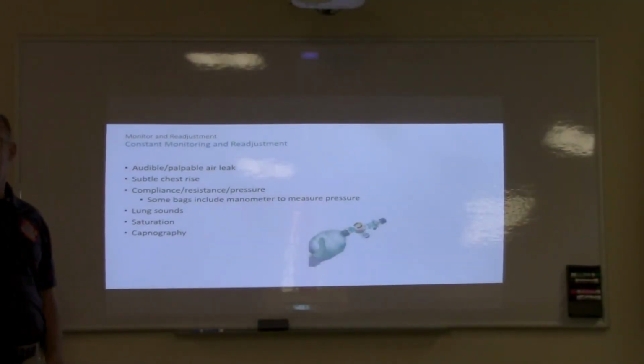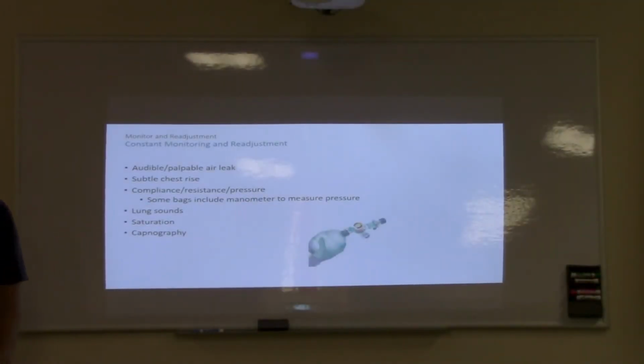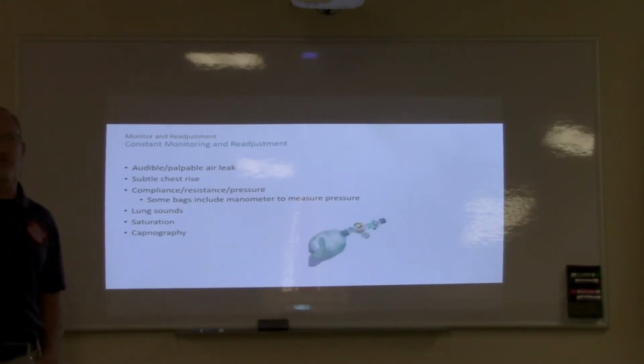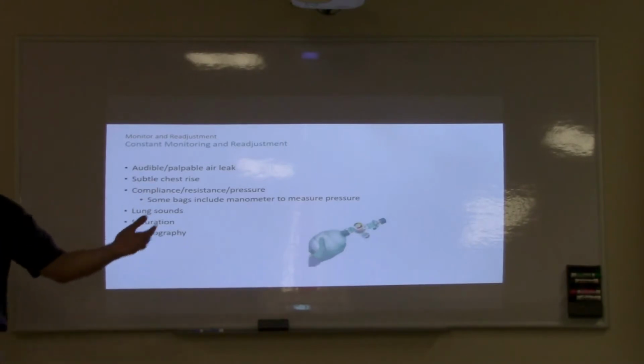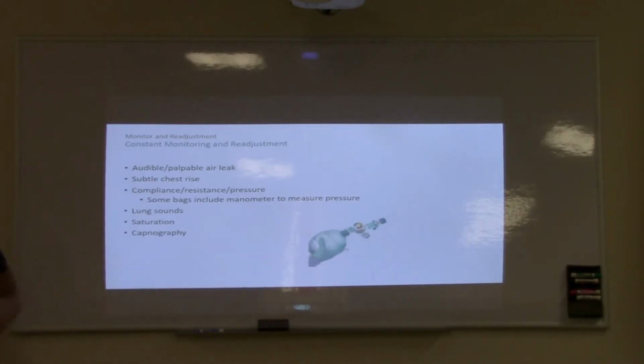And so a lot of you have gotten comments back, because it's pretty easy to see on the code summary for patients that are in arrest. You can just look down and see when the capnography appears. You can just see, oh, it's 8 minutes into the code, it's 3 minutes into the code, it's 20 minutes into the code. So the idea is to do that, if possible, at the very beginning of your code.